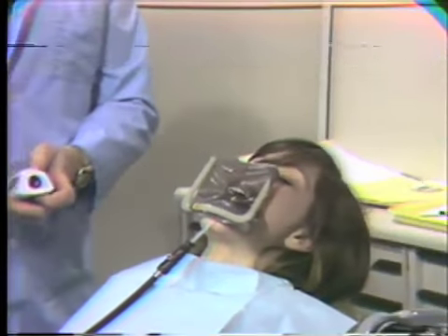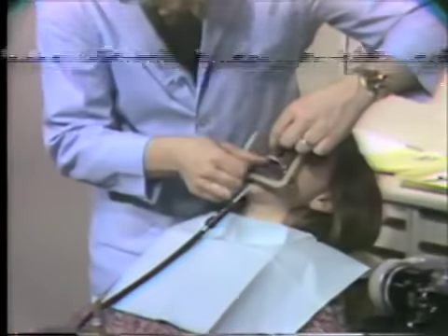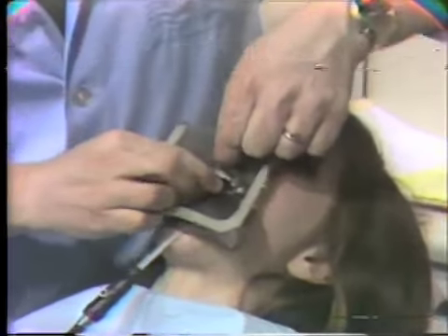Now the next thing we're going to do is go ahead and do our ligation. What we use is a heavy dental floss. We'll place it around each tooth. Let's start with the central incisor here. We'll try and work that rubber dam subgingivally if we can.